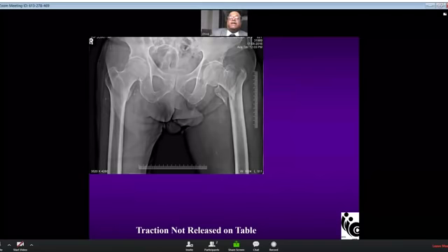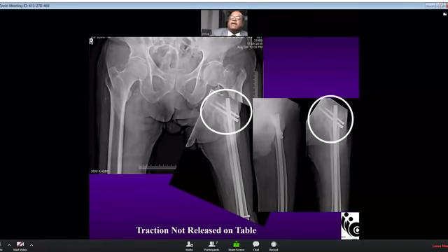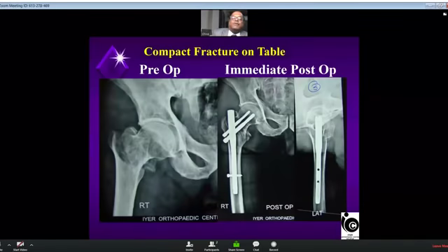The second thing is not releasing the traction, which will cause the screw to back out. As I said earlier, that was talking of the screw. So you have to compact. See, this is the immediate post-operative X-ray. All the screw tips are subchondral and the screw heads are touching the lateral cortex. I have released the traction and compacted the fracture on table beautifully so that in the immediate post-operative X-ray, the screws are not backed out.